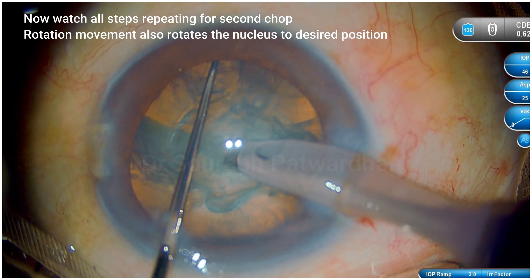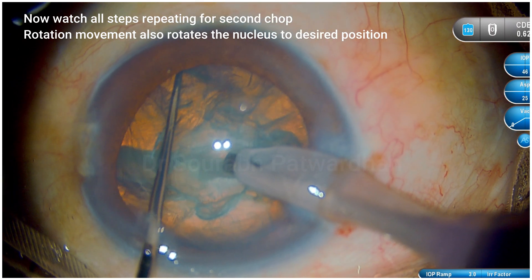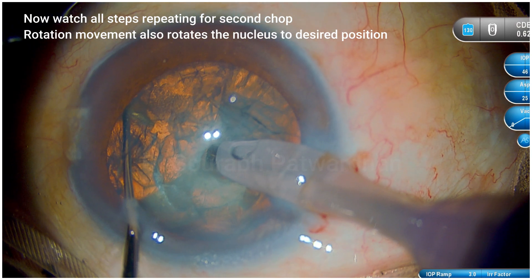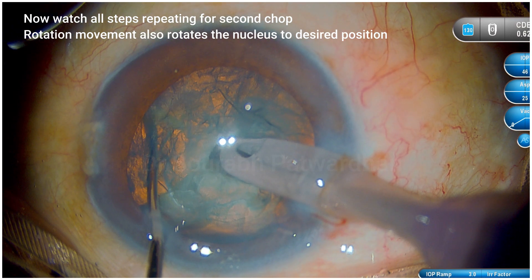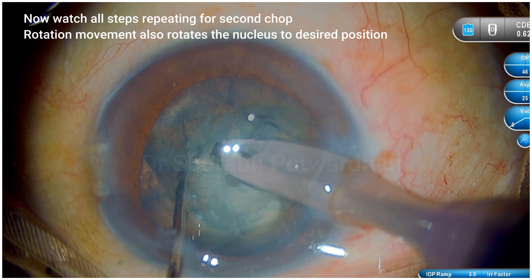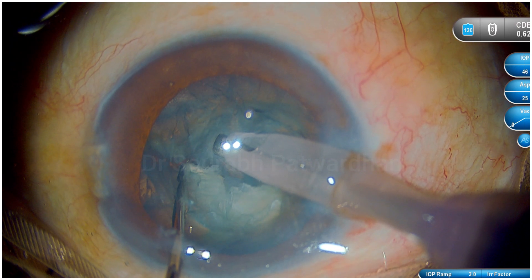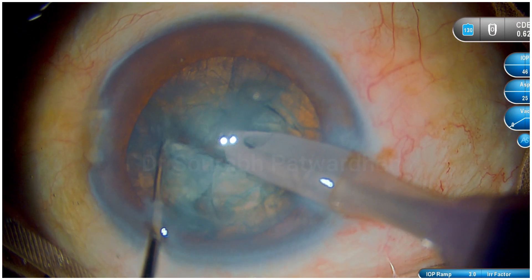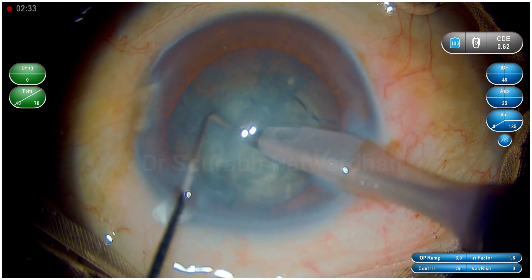Now watch the same steps for the second chop, and you can see that as I move across, the nucleus itself rotates. So it brings the nucleus in the right position just by that circumferential movement across the edge of the equator, and that makes it very easy and very fast in workflow.